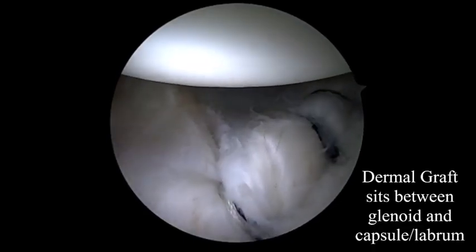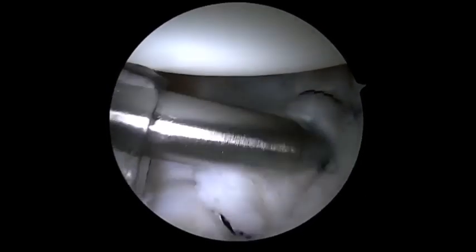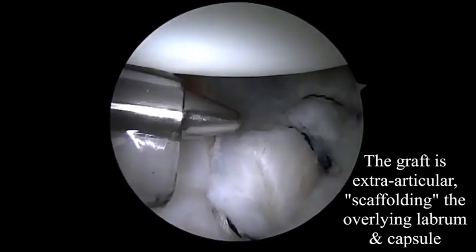The final product shows you that the graft is sitting in an extra-articular position, buttressing the labrum and filling the area of bony defect with a dermal allograft.